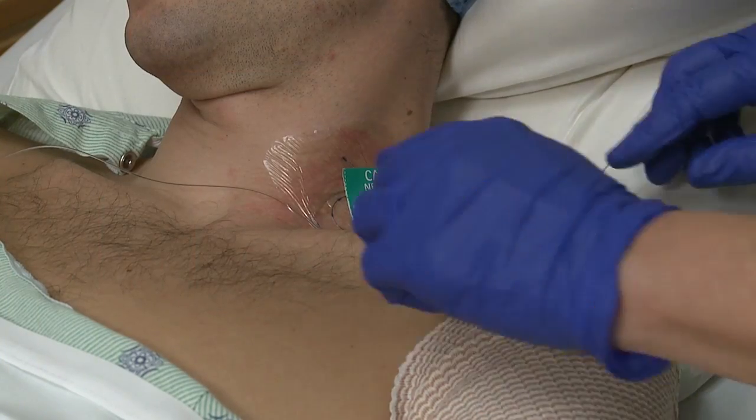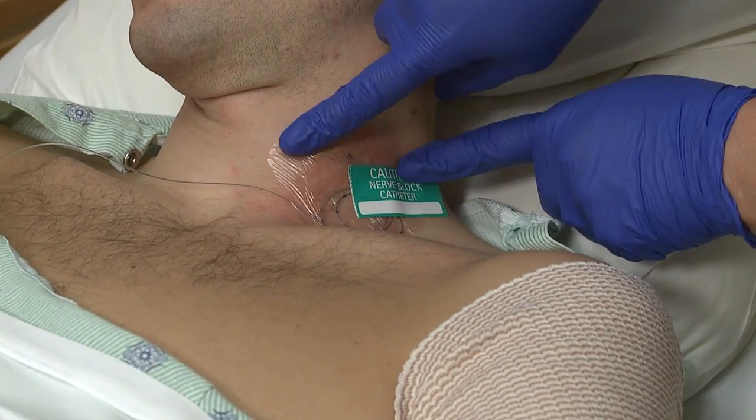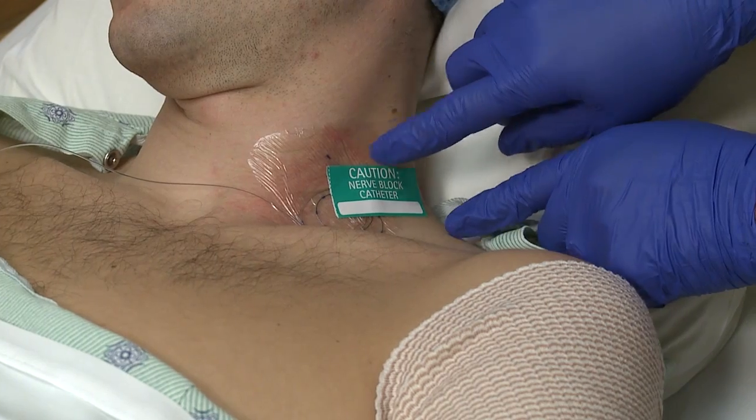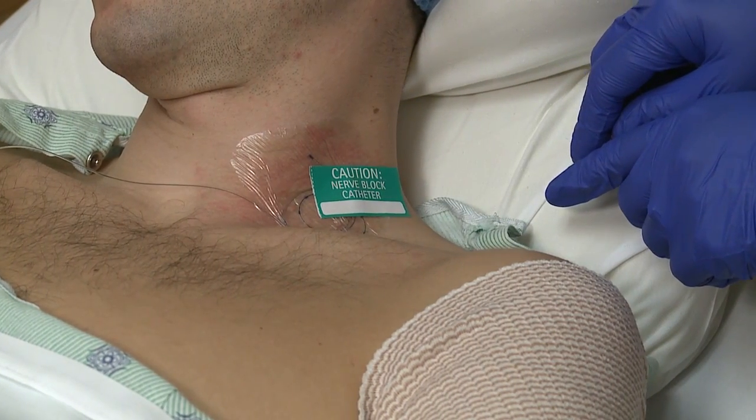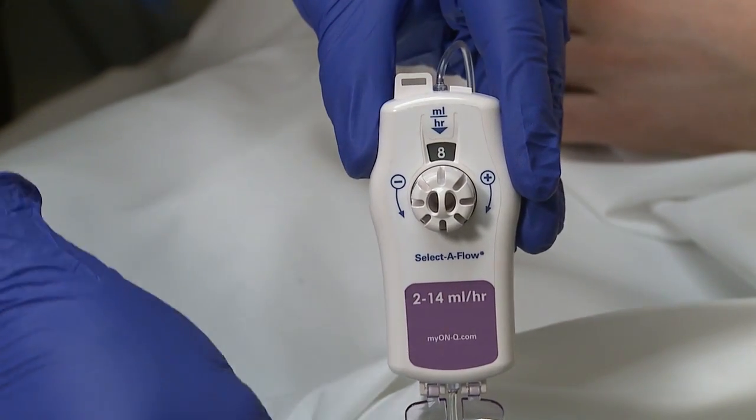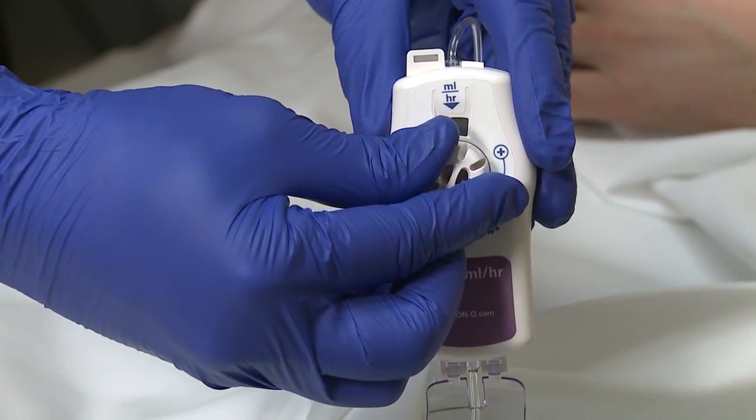Keep the bandages over the catheter clean and dry. There may be some fluid leaking at the insertion point, and that is normal. As long as enough is getting in to keep you comfortable, it is of no concern. If it is leaking and you're not comfortable, you may need to turn up the rate to compensate for the leak.